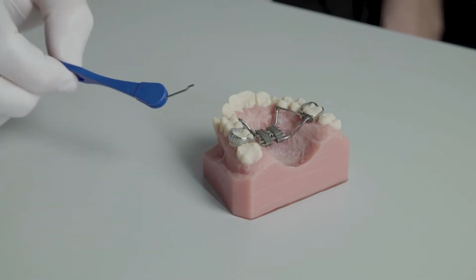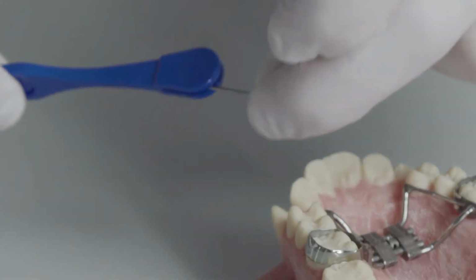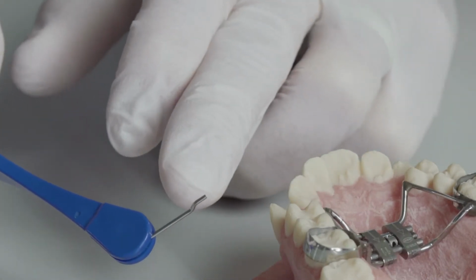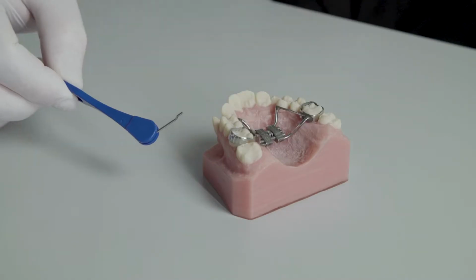The expander key consists of a plastic handle and metal tip that can rotate. Notice that there is a bend on the key to prevent you from inserting it too far into the expander. Now let me show you how to do a turn.